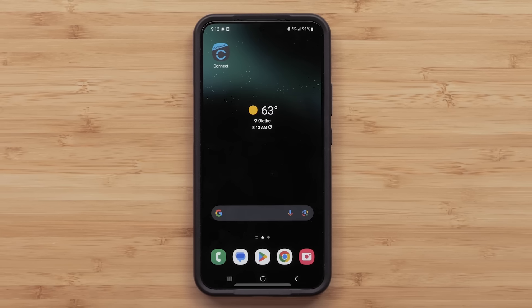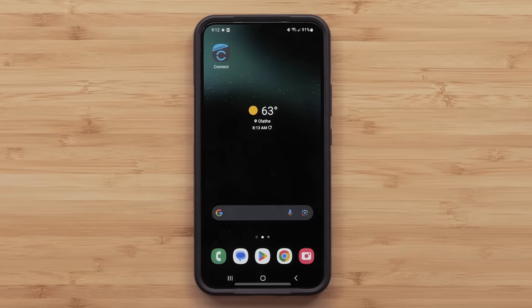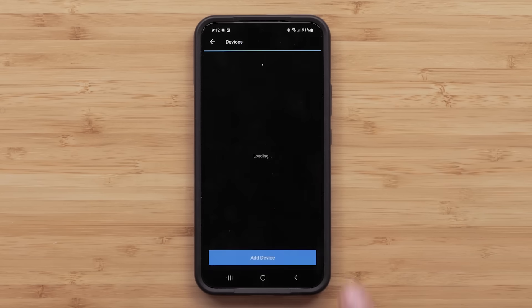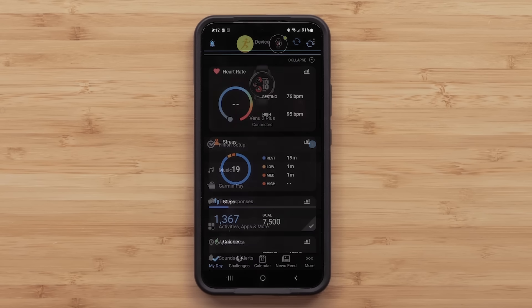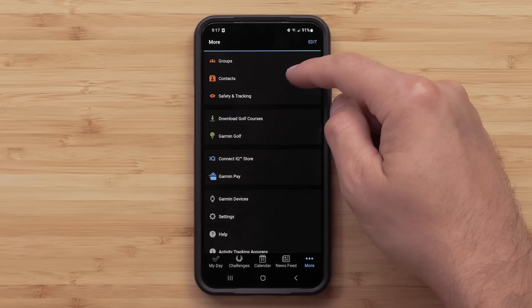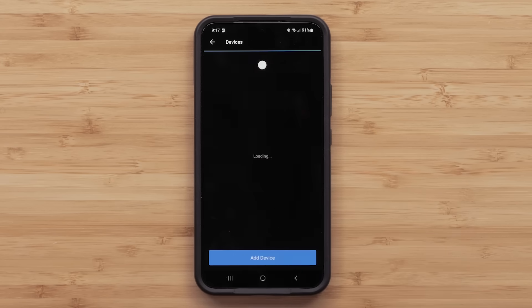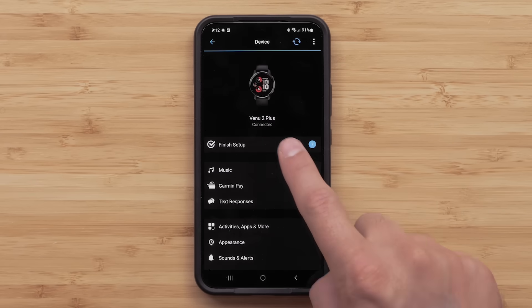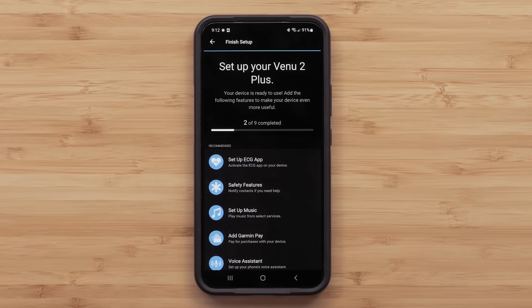With your smartwatch paired to your compatible smartphone, open the Garmin Connect app. Select the device image at the top of the screen. If you have more than one device paired with Garmin Connect, tap the More icon. Then select the device you'd like to set up. Tap Finish Setup, then select Setup ECG App.